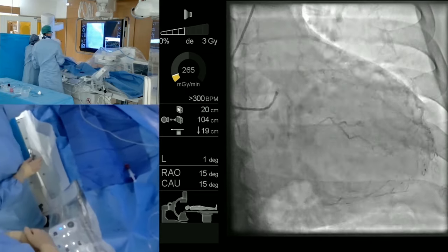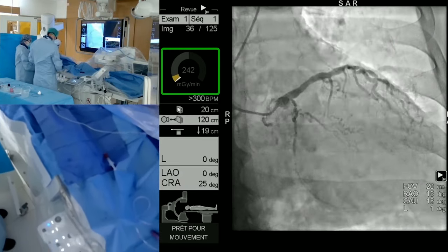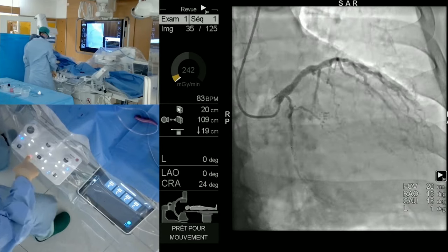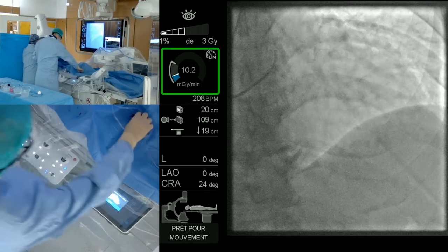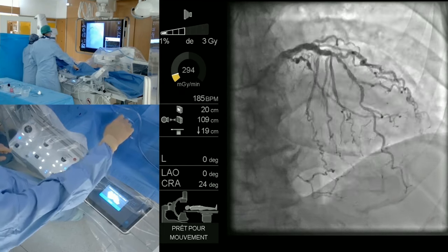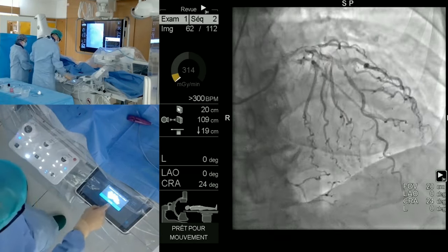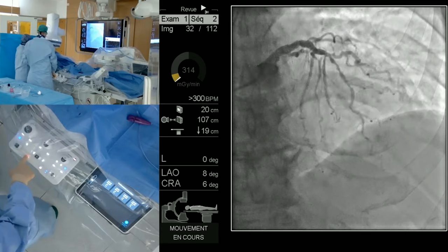On the dose optimization, you can see the graphical color-coded display of the real-time dose rate, like a car speedometer. It appears in blue during the fluoroscopy and in yellow, like here, during the graphy. Here is the fluoroscopy. And in this case, for the fluoroscopy, we use 3.75 images per second, and for the graphy, here, it is 15 images per second. So we work with a scopy.